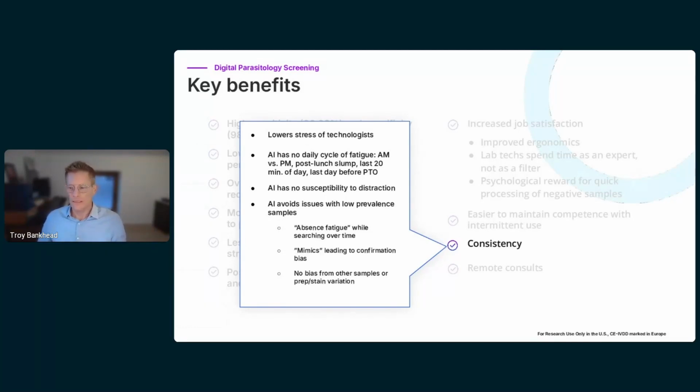And so all of those things the AI does really well, but the human can make those calls that John pointed out that today we do need the operators for. And when I say we need the operators, there are some other solutions that just present the results. But we prefer to have higher sensitivity and specificity in our tool.